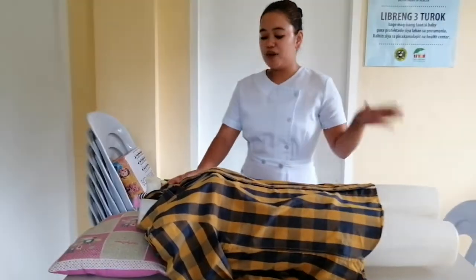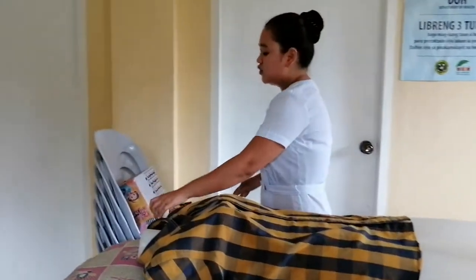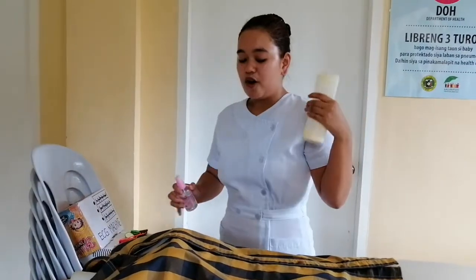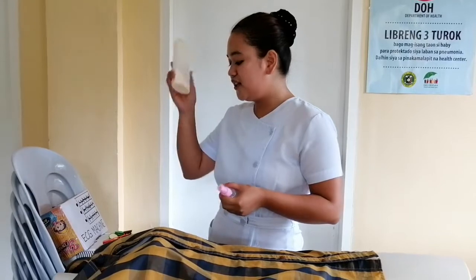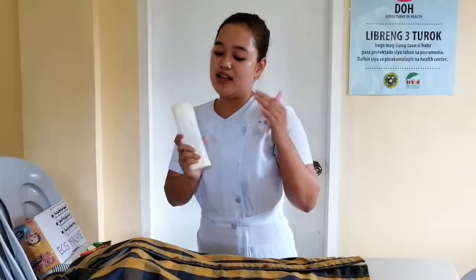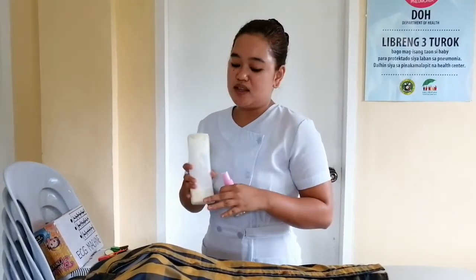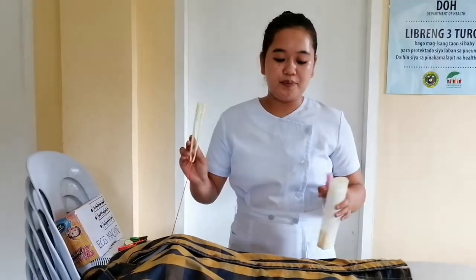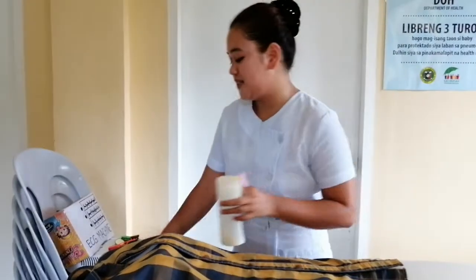Before I proceed to the proper return demonstration, I just want to introduce the equipment and other materials I will use. I have here an electrogel. What's the purpose of this electrogel? It will help establish an attachment between the skin and the leads to be placed on the different parts of the body, the chest and the lower and upper extremities.